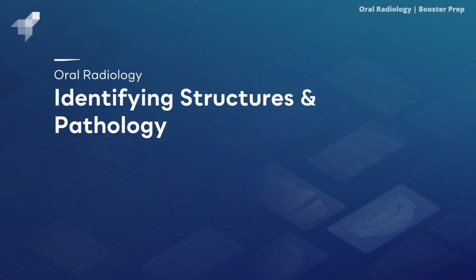Hi everyone, welcome back. I'm Pooja and we'll be continuing our oral radiology series for the dental hygiene boards by identifying structures and pathology. Let's get started.